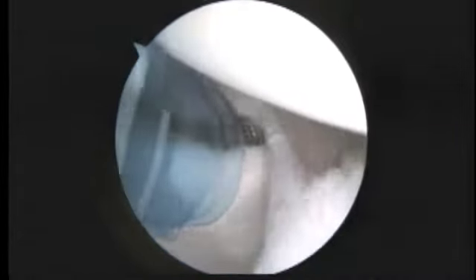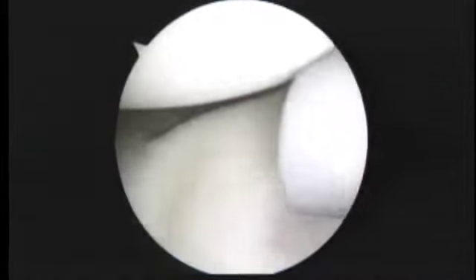Okay, so here's what we're looking at. We're looking down the front now. We see some labrum, it's a little bit thin. This is the anterior band of the inferior glenohumeral ligament, right there. And we're just trying to scuff things up a little bit to create a healing response. And we're going to place one anchor, right? One anchor in the front, because it's going to give us a little extra security.